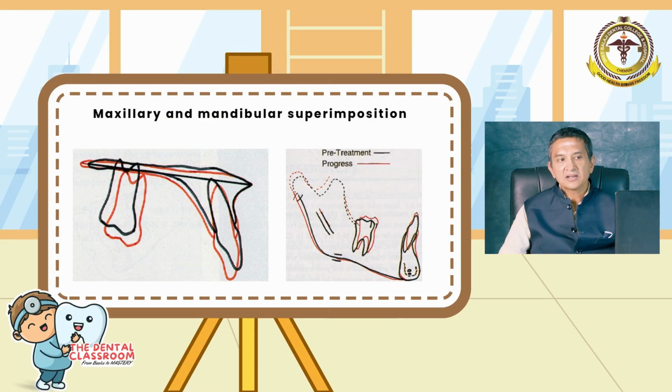So, coming to clinical orthodontics, we can use this to see what changes were brought about by natural growth, abnormal growth, or treatment-related changes. For this, we use what is known as a superimposition. That is, we take two cephalograms taken at different time points and we put them on stable structures, stable meaning structures which do not change, and then we see the changes.